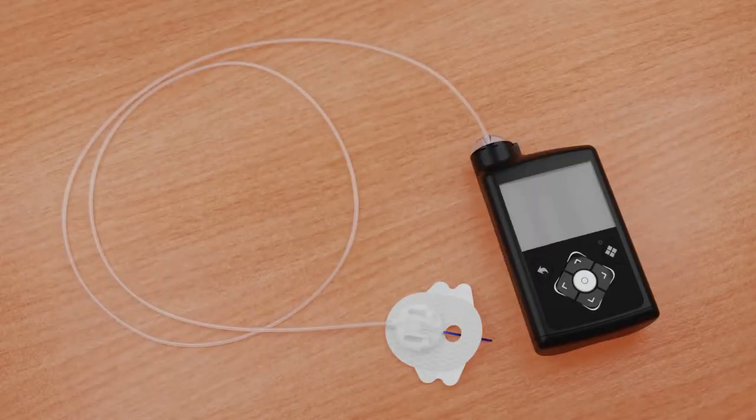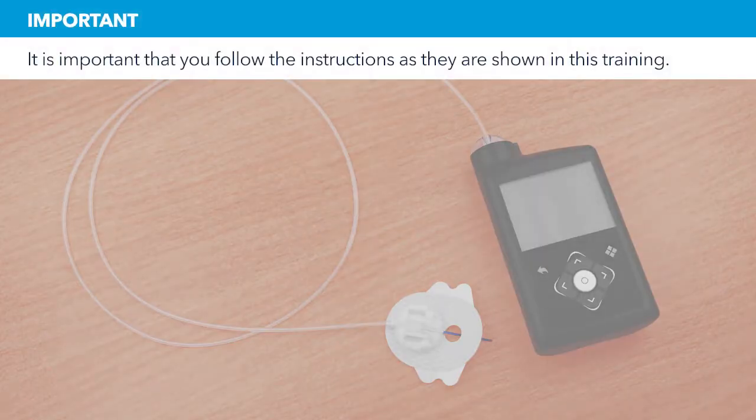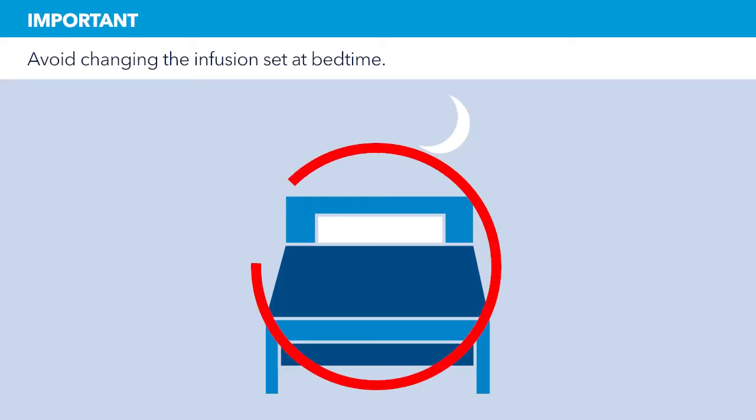This video will show you how to fill the reservoir and insert the infusion set. It is important that you follow the instructions as they are shown in this training. Try to avoid changing your infusion set before bedtime unless you're able to check your blood glucose 1 to 3 hours after inserting.